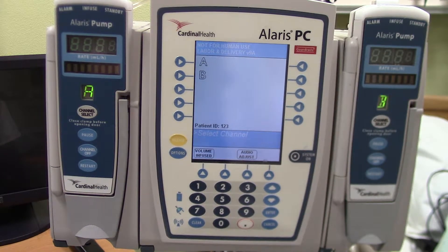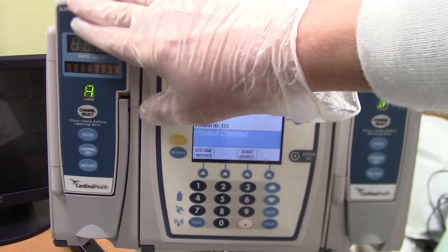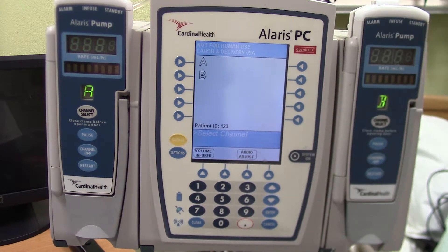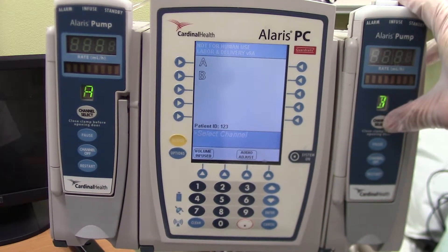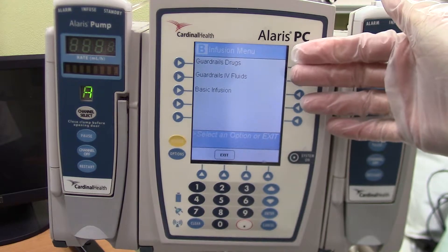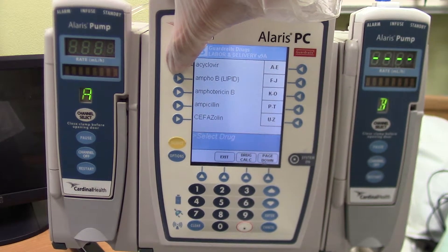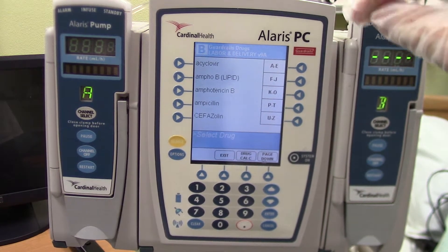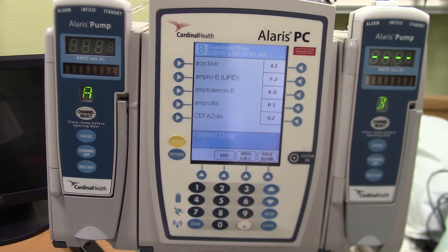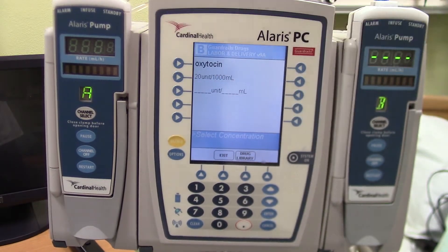I need to select one of these channels to program. Perhaps I could run some normal saline in one channel, and I'm going to go ahead and program the Pitocin in the channel that has that tubing in it. I'm going to select channel B because that's what the Pitocin is in. Once I select it, it's going to give me some options. We're going to use the pre-programmed options such as guardrails drugs. I need to find the drug, which would be oxytocin, and here we have oxytocin or Pitocin. I'm going to select that.